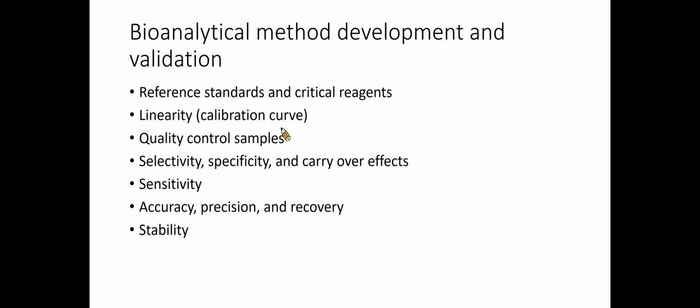Method development involves optimizing the procedures and conditions involved with extracting and detecting the analyte. Method development includes the optimization of the bioanalytical parameters listed in these slides to ensure that the method is suitable for validation. In the following slides, we will introduce each component in detail.